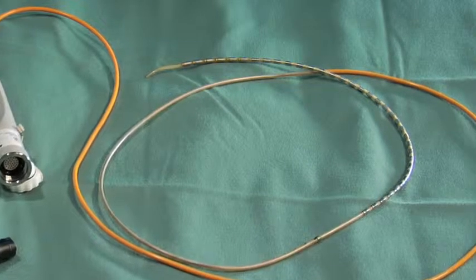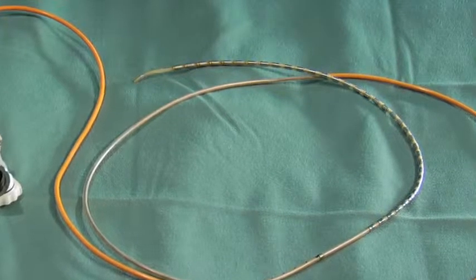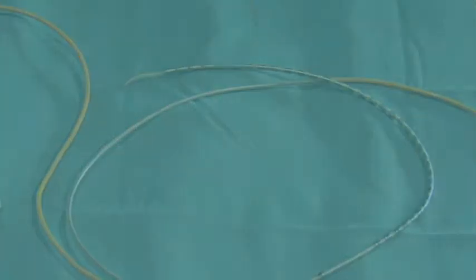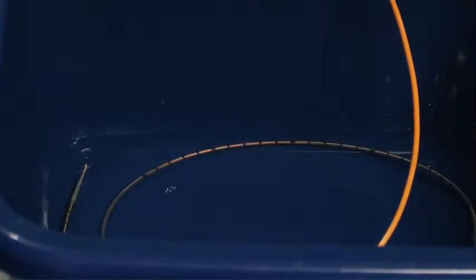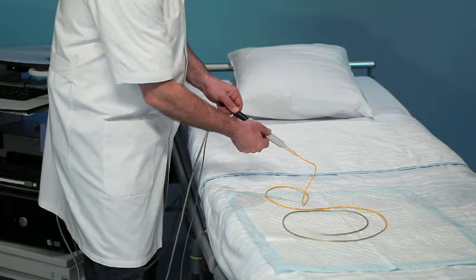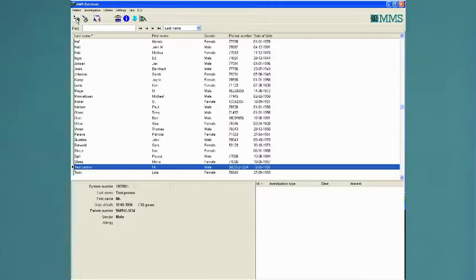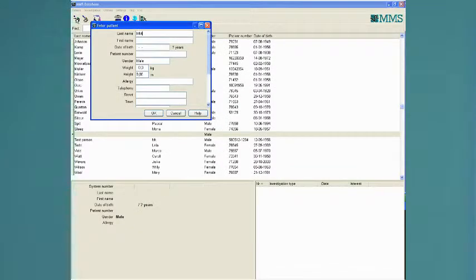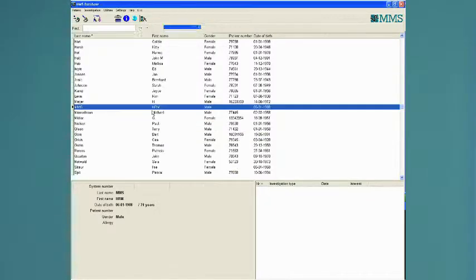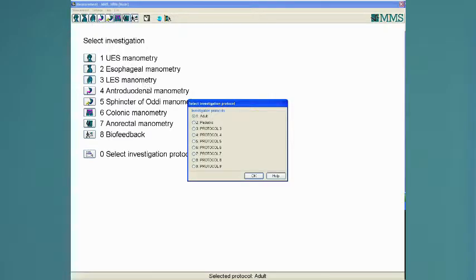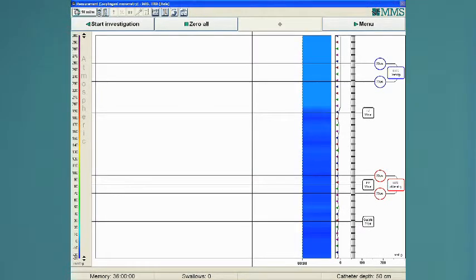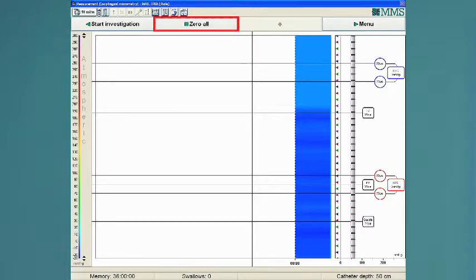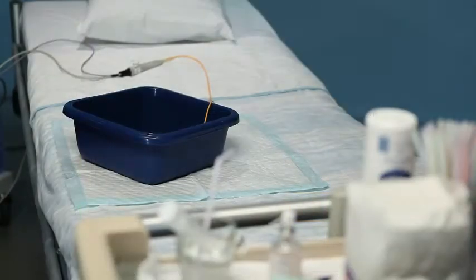We will now explain this procedure. Put the catheter in water to pre-wet. Connect the catheter to the system. Start the MMS software program to enter the patient demographic information. Select the investigation protocol and start the examination. Zero the channels of the catheter.